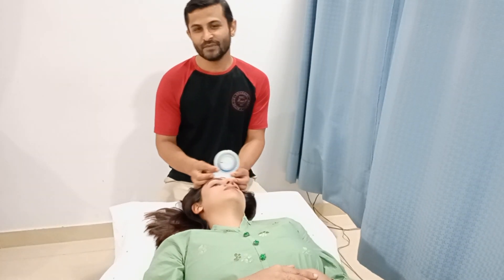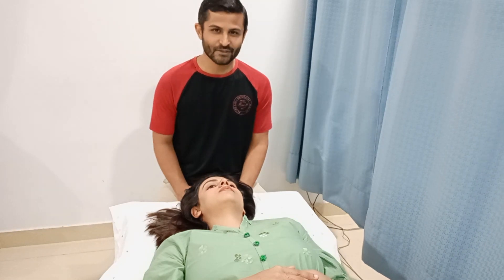So that's how it is done — it is very easy to perform. I hope you like this video, thank you very much.